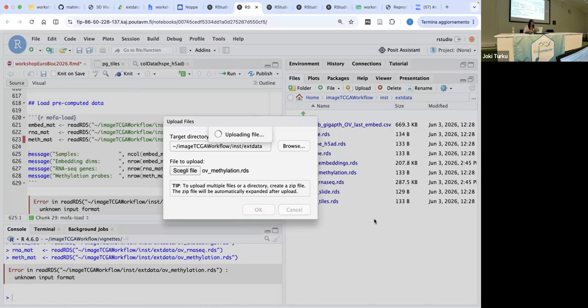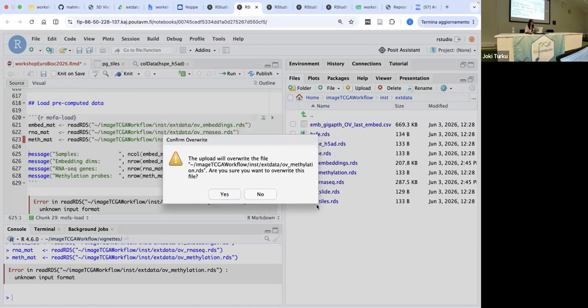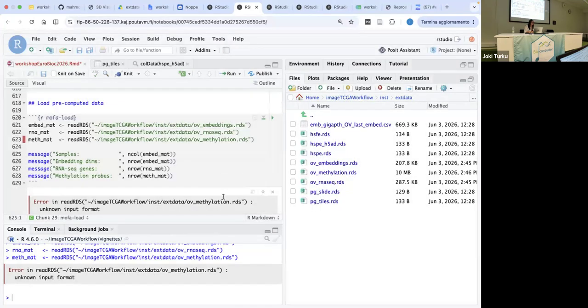No, there are no stupid questions. It's like after you have gone through the process of converting the images into some sort of tabular data, it's like spatial omics data. So that would mean that at that point, most of the spatial omics methodologies can be applied.